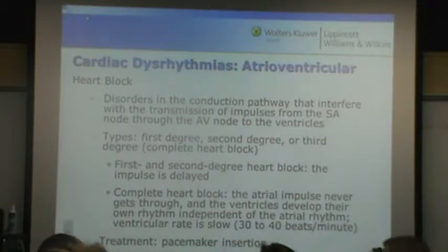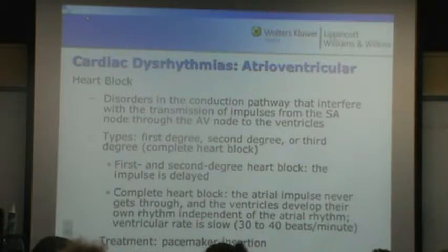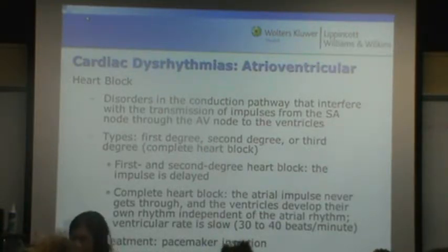If they show up and we never see a normal sinus rhythm in there anywhere, we consider it SVT. But when we watch it come and go like that, we refer to it as paroxysmal. So yeah, it's SVT. All right, just write that on there.